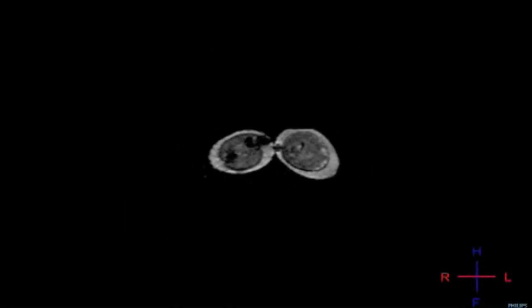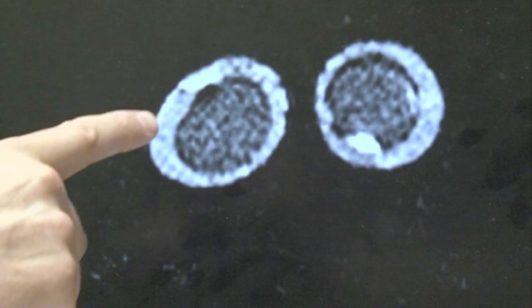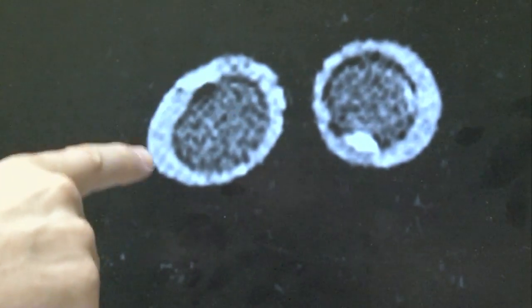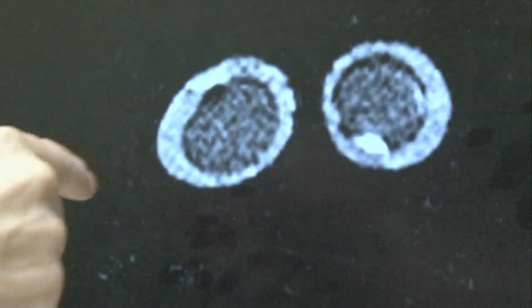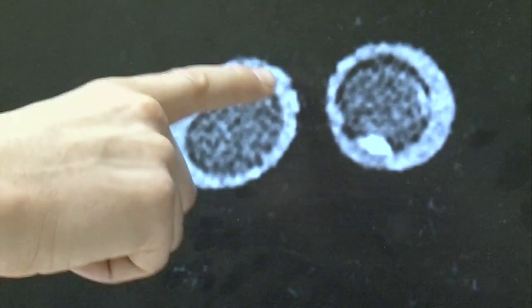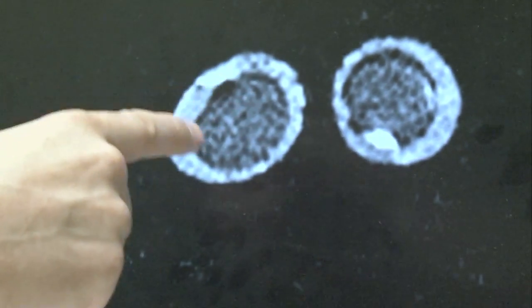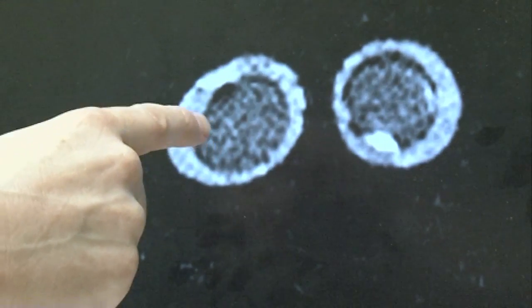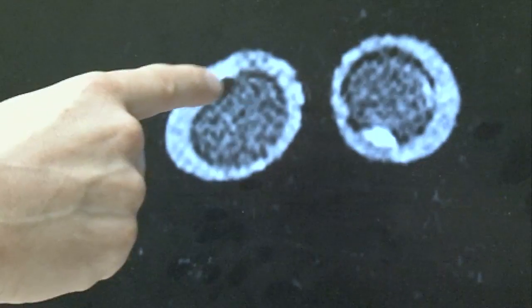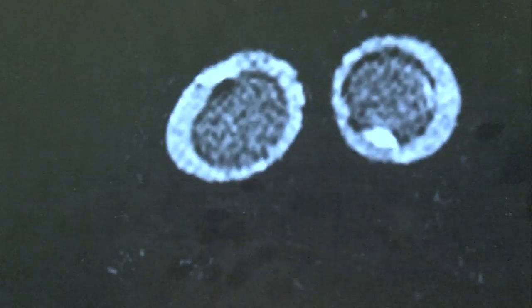We actually put in two cream eggs just to get a bit of a stronger signal. The bright region here around the outside is the chocolate — probably what we're seeing there is the fat inside the chocolate. So we're seeing the hydrogen nuclei in the fatty part of the chocolate. Then inside, the slightly darker mottled region is the creamy filling, where we're probably seeing the water, which is also giving us a signal. But there's also fat in there as well giving rise to a signal.